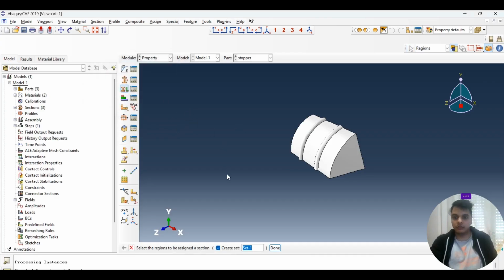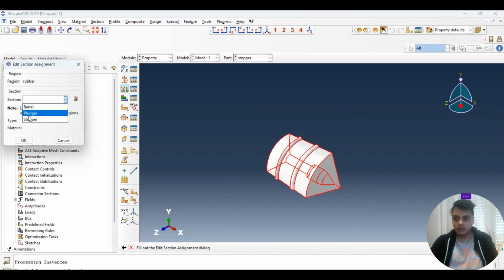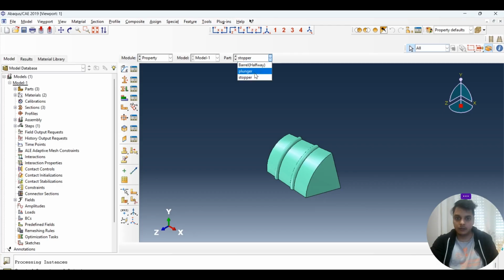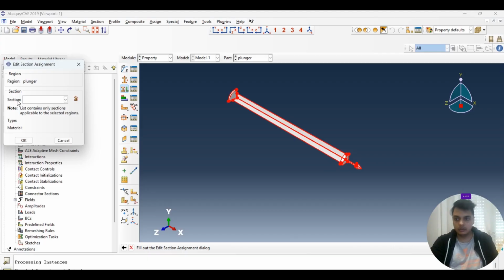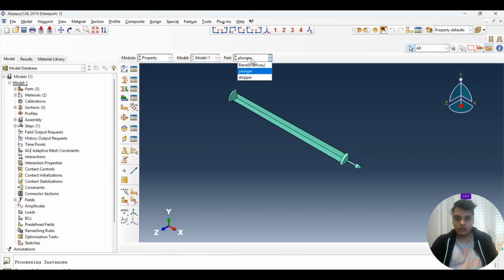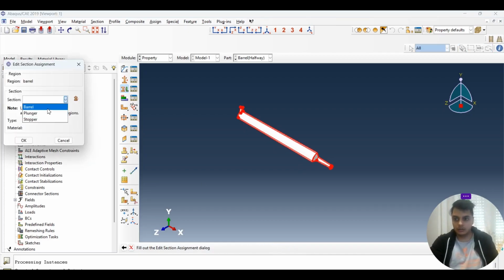Now it's time to assign the section. This is really important. If I'm assigning a section, try to write it down here also for simplicity. You create all the sets. So select it, give it a name, and this one is a stopper. Now we want to assign for the plunger. We are going to go to the section, assign. It's the plunger part. So it's done. Then we have the barrel. So again, assign the section, give it barrel here, and assign it to the barrel.